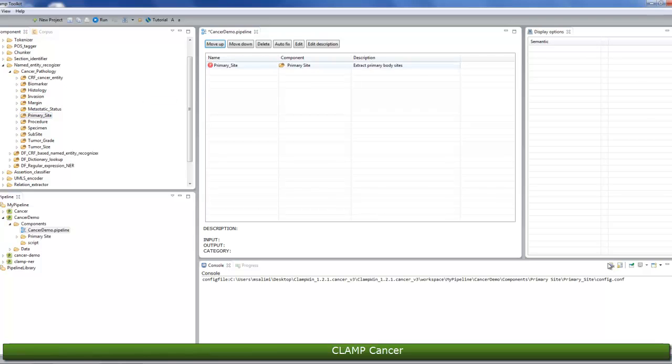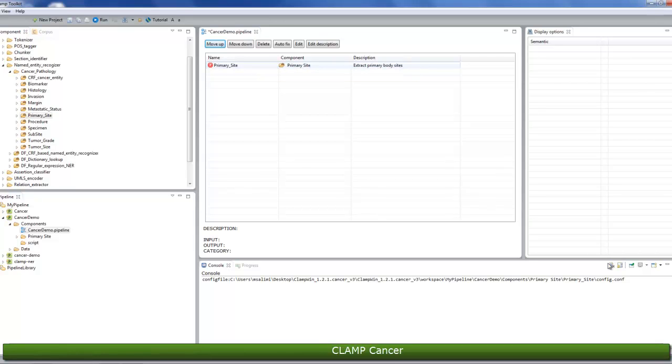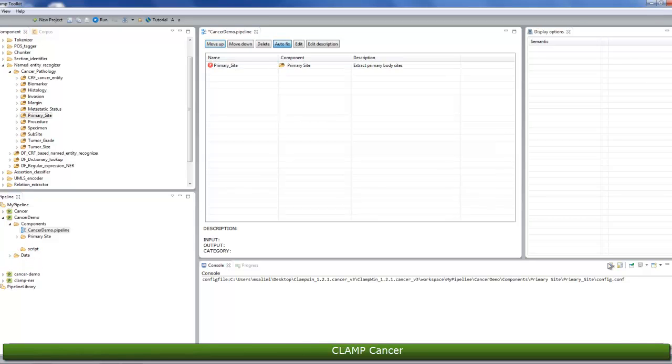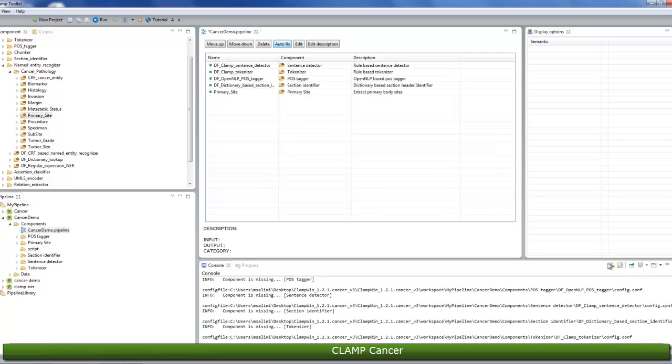Upon dragging the folder, you will notice a red X sign next to the name of the folder. The sign indicates that the component is dependent on other NLP components that are missing from the current pipeline. To fix this issue, simply click on the autofix button at the top of the panel. This will automatically add the required components to the pipeline.